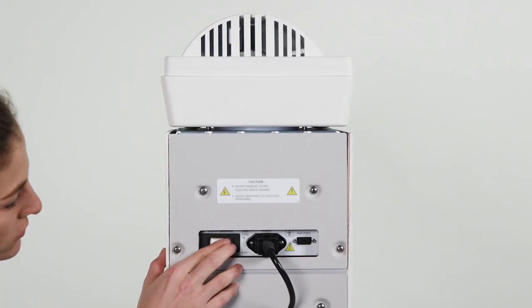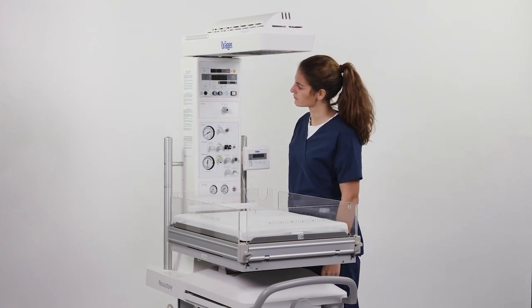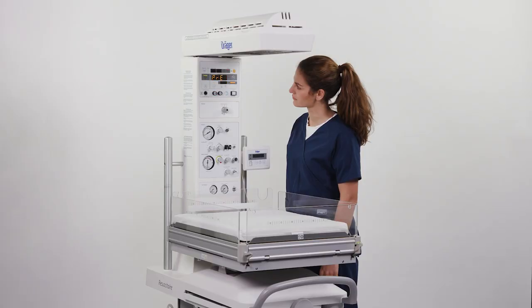Turn the controller on using the on and off switch. After a brief self-test, the device will beep. When the test has passed, you can begin to operate. The device will start.